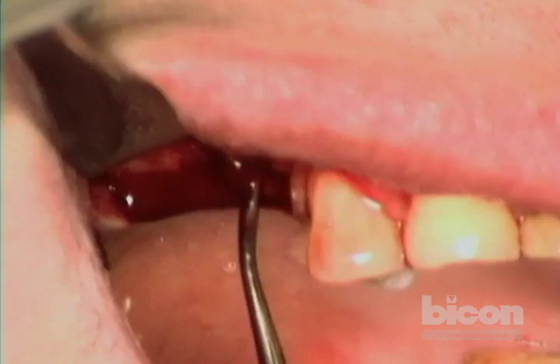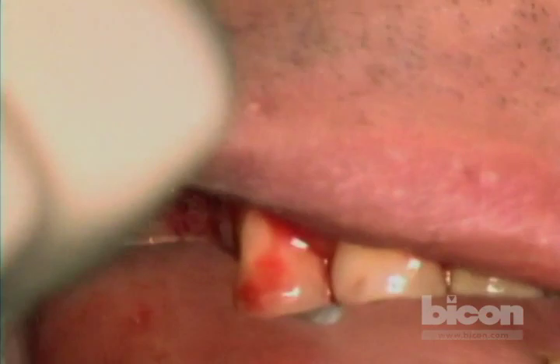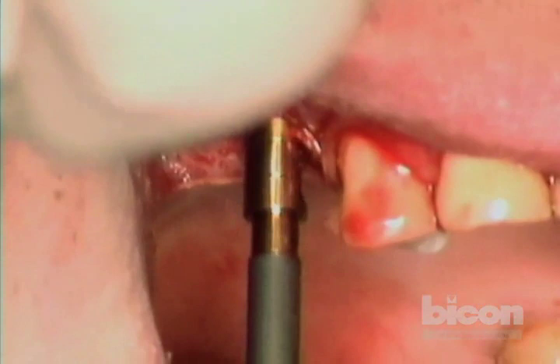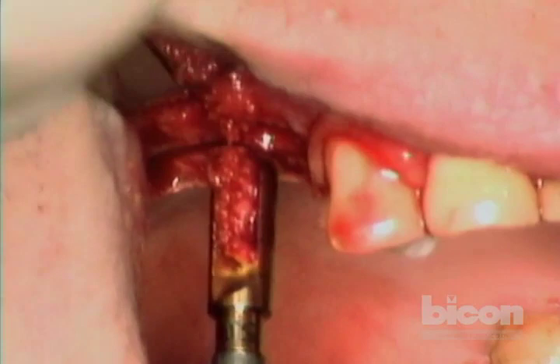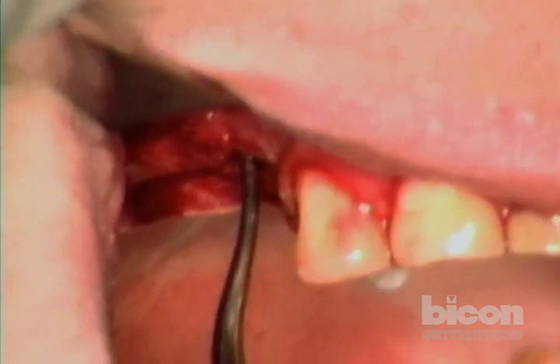The patient confirms no pain. Finishing up by hand — using the hand reamer by hand. Although it appears I could go even wider, the bone here is all grafted and starting to break open a little bit, so I don't want to strain it. A five by six or five by eight will be fantastic. Before we go to the sinus lift, we verify that our floor is still intact with no holes or perforations.